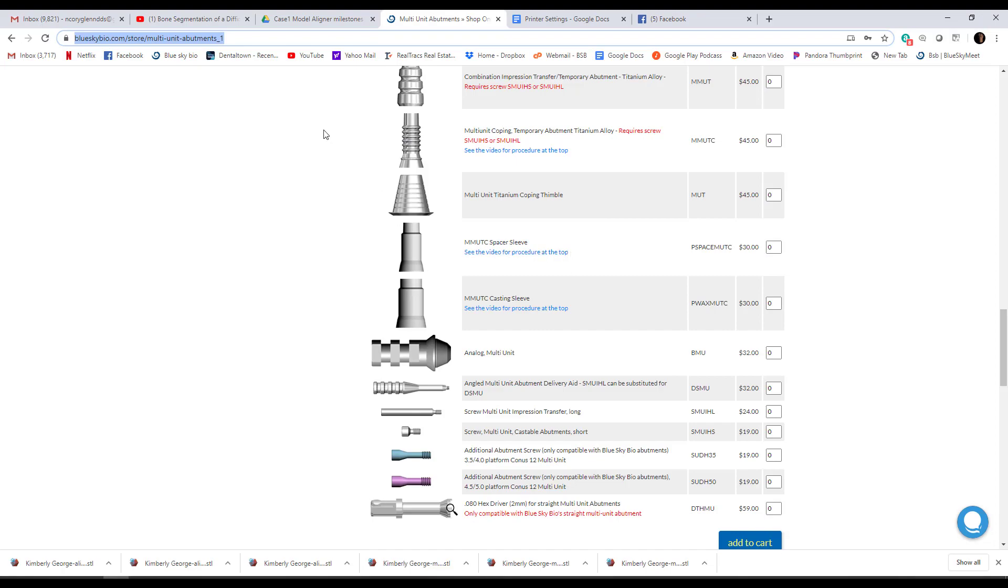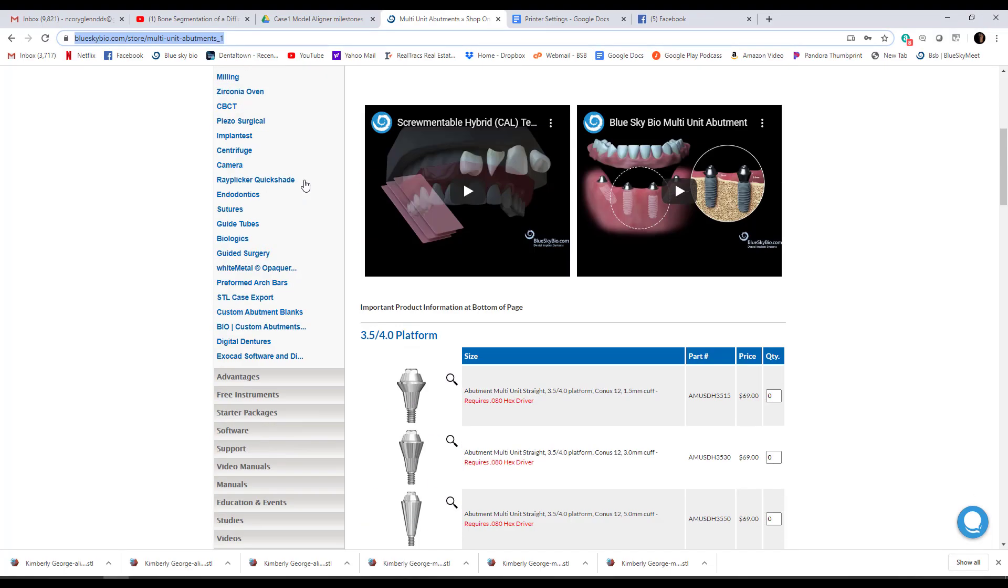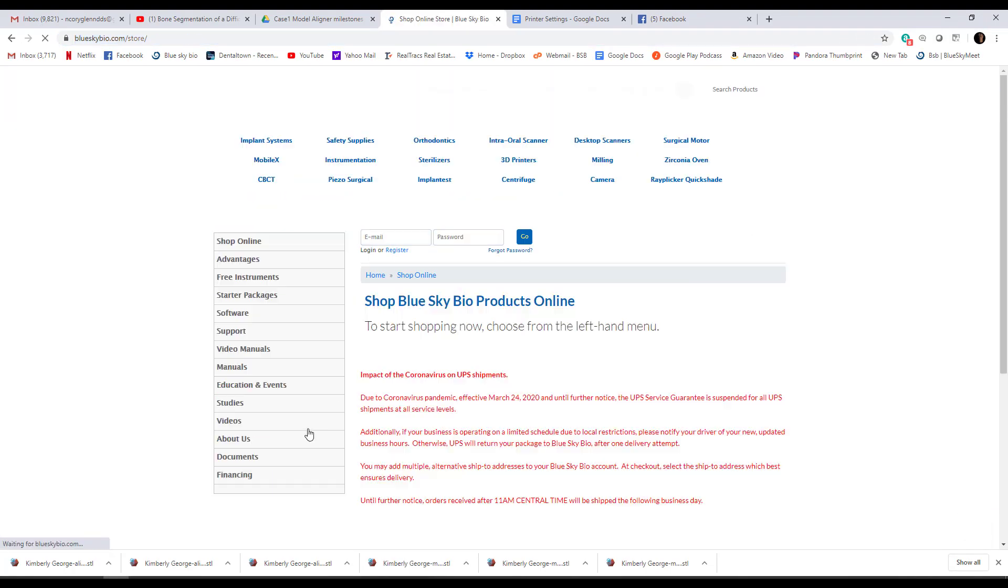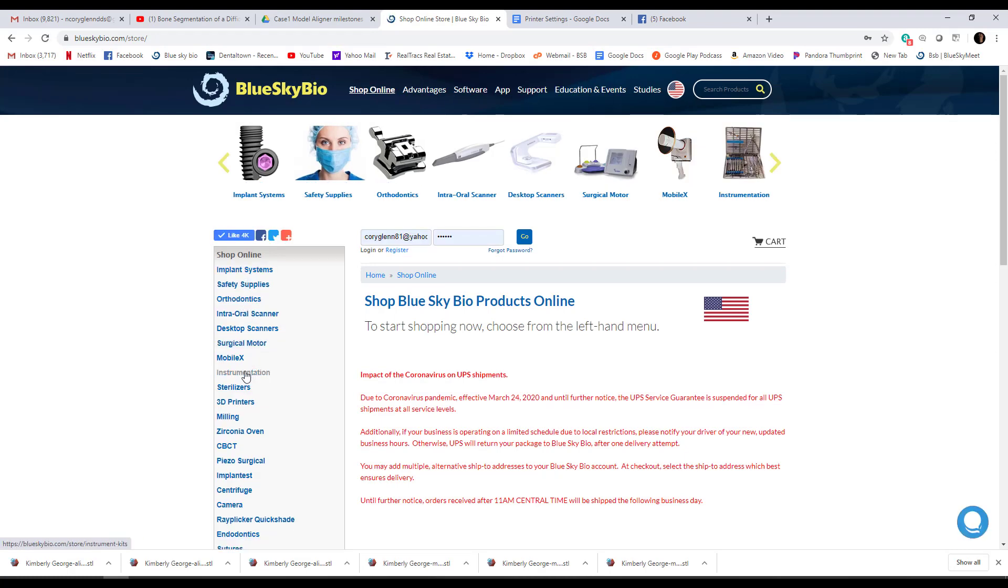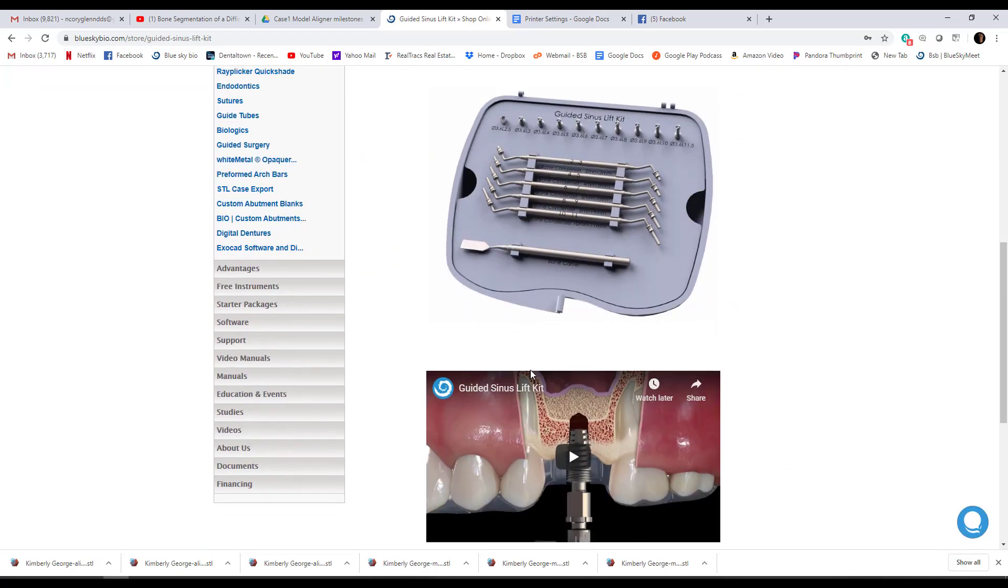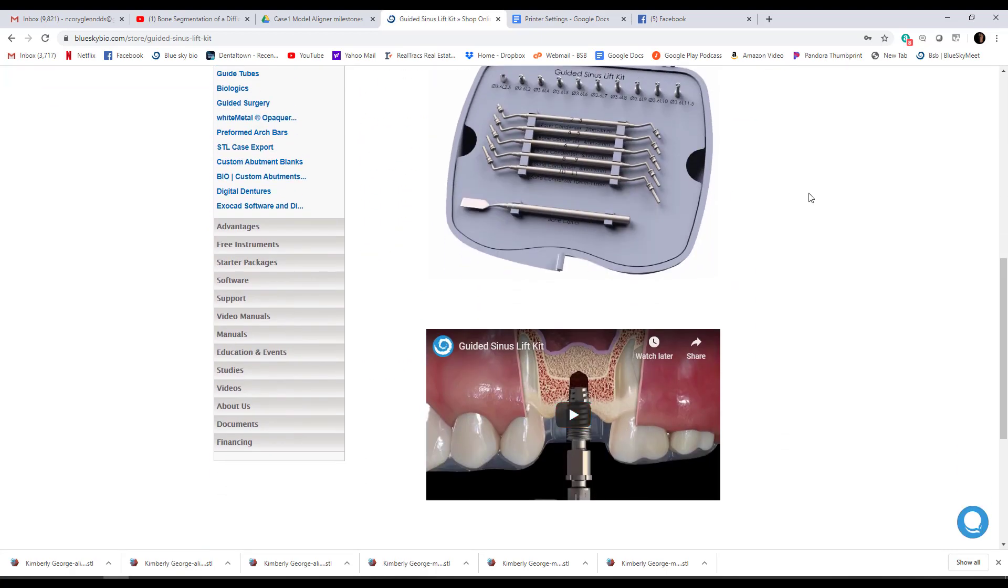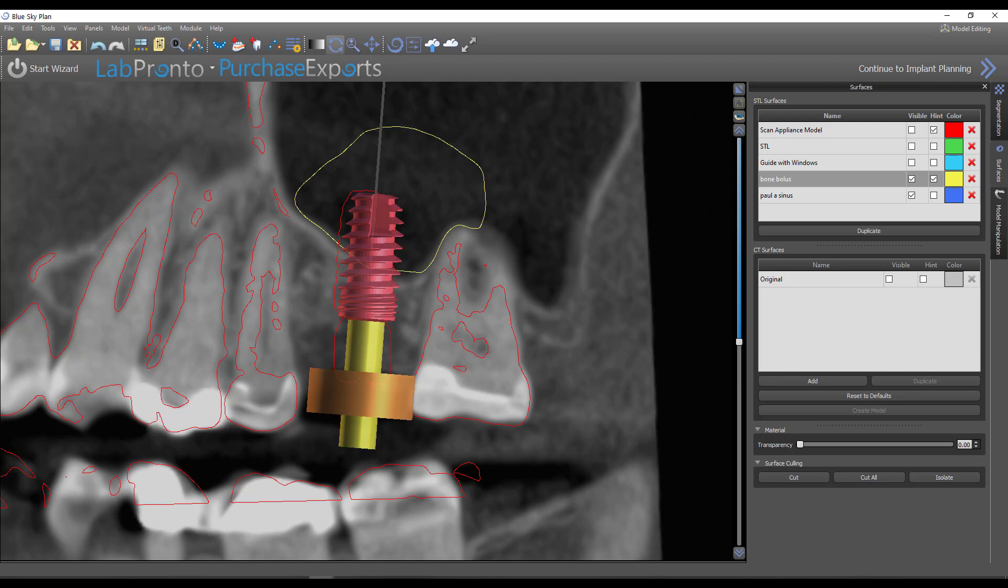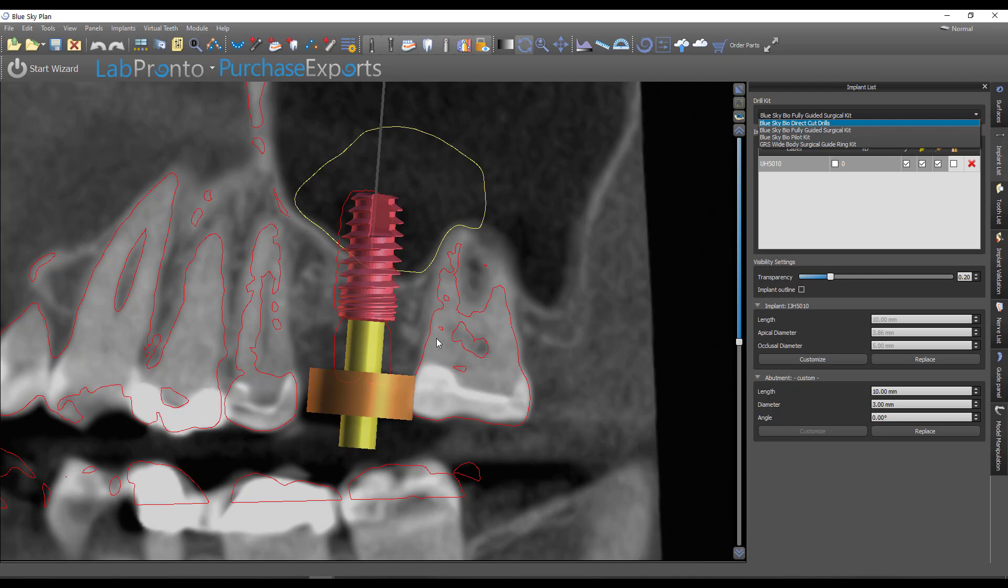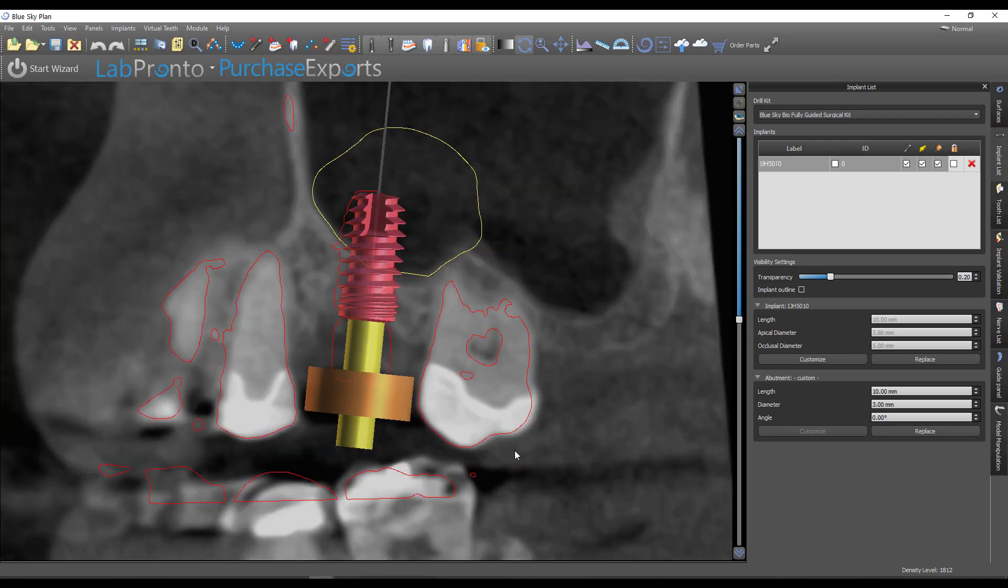If you're looking for it, go to the BlueSkyBio shop online page and then go to instrumentation and you'll see the guided sinus lift kit. And here you see the kit. This is completely compatible to our keyless guided surgery system. So if you're planning it in the software, all you're going to do is just tell the software in the implant planning stage that your drill kit is the fully guided surgical kit. And that will set all the parameters for the guided sinus lift kit as well. You would just simply measure again, we measured five millimeters preoperatively. So you would expect to break through with either the five or the six millimeter drill. So it's a very intuitive kit. Anyway, I hope you found both those things useful.